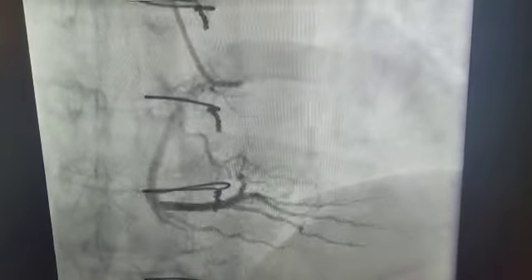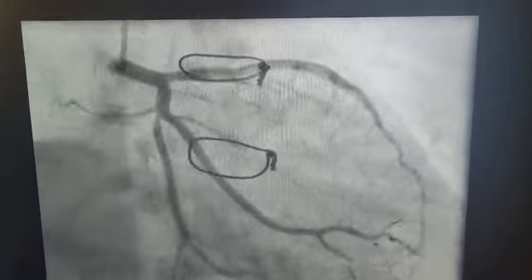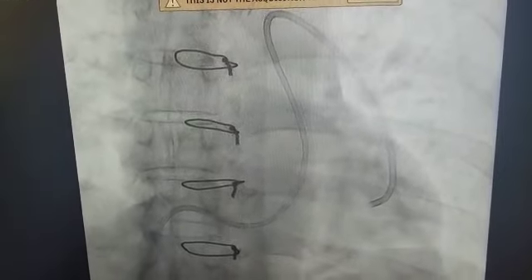So this is a post-transplant patient. The protocol is to first make a coronary angiogram, and if there is a graft rejection and if there is a diffuse vasculopathy, then one would consider an IVUS or CT-FFR and a drug-coated balloon. So here we have used a Mullen sheath.